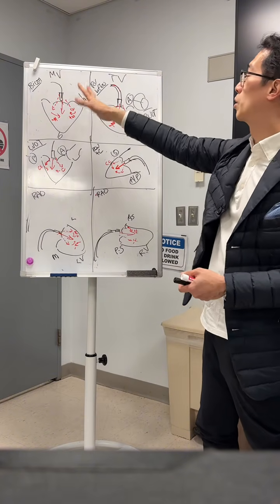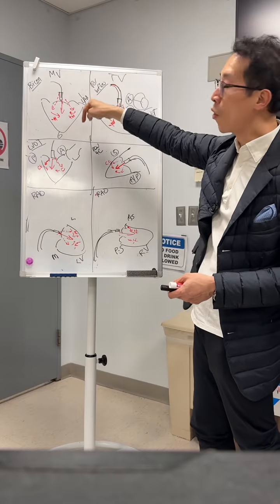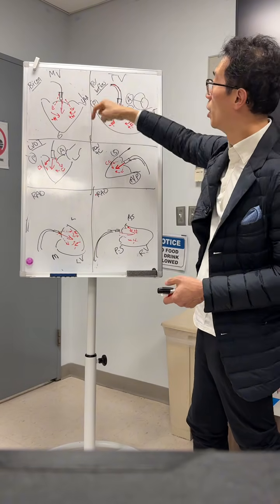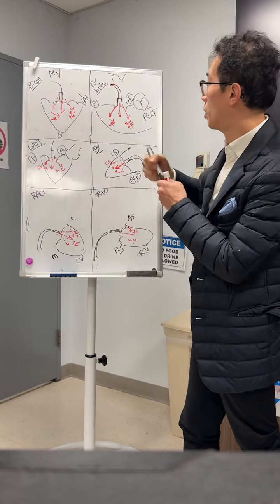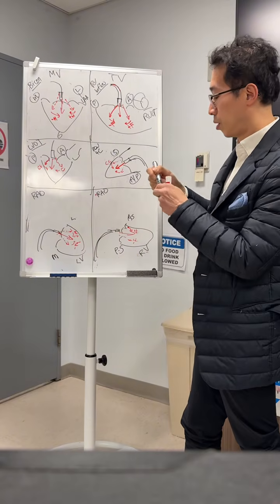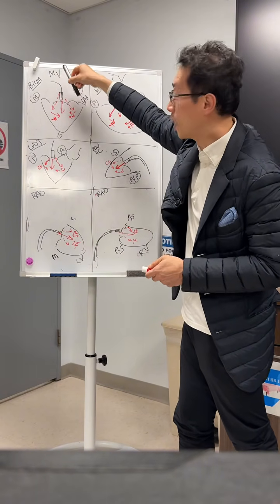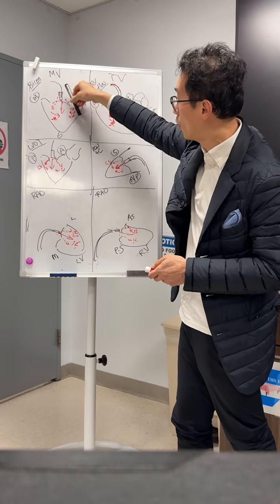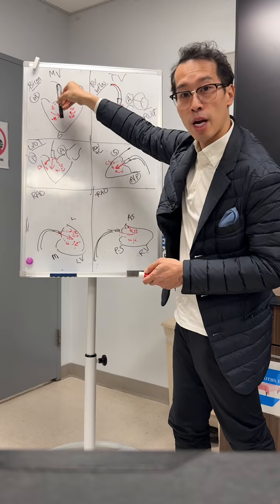So again, going back to the mitral valve, just to summarize, in terms of going into the ventricle, in terms of trajectory, you want to go straight down. Okay, this is a bicommissural view. This is lateral. This is medial. This is going straight. On the mitral side, if you start going a lateral dive, you need to add M. If you go in a medial dive, you take away M.